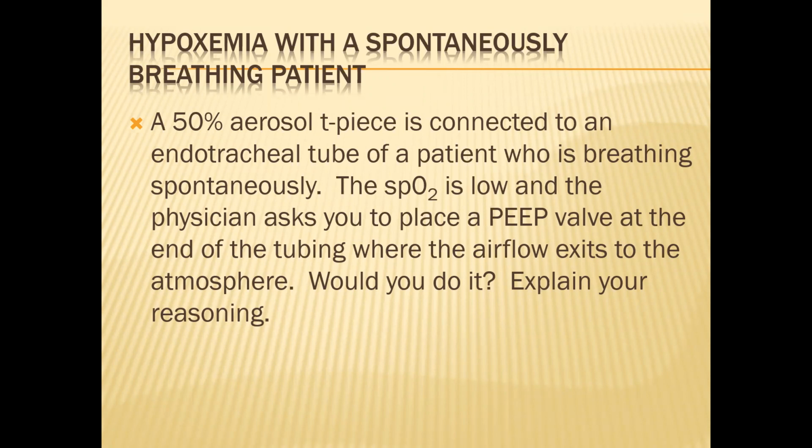So an aerosol T-piece on an endotube. You know how you have that 5 inches of corrugated tubing and then you've got the air flowing out through the corrugated tubing? And then the patient breathes in and then they exhale. No, no, just an aerosol T-piece. No, they weren't extubated.